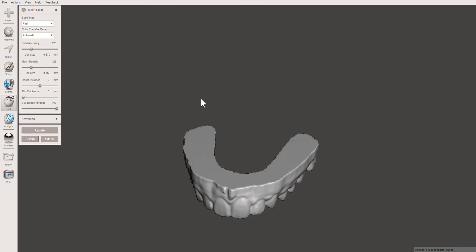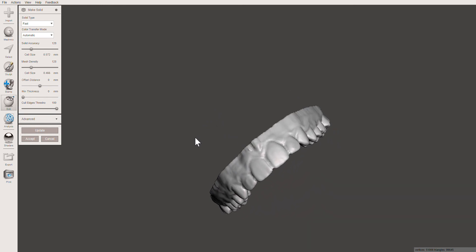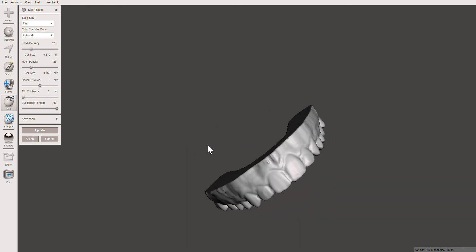Now that we've got our solid model, I'm going to bring back a little bit of the definition by increasing the Solid Accuracy and the Mesh Density, then update that.